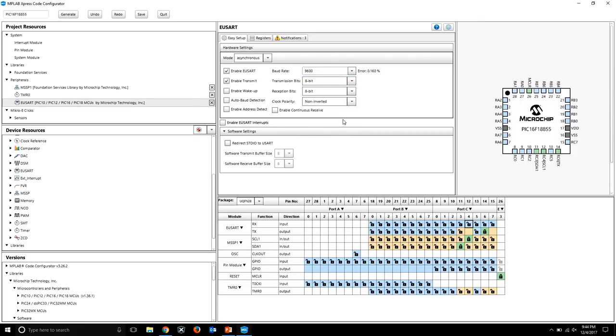Now down below, what we are going to do is redirect standard I/O to EUSART. So I'm just going to redirect the I/O to this EUSART. I'm just going to check that box. It's as simple as that. Just check that box, and it will do that configuration in the background.